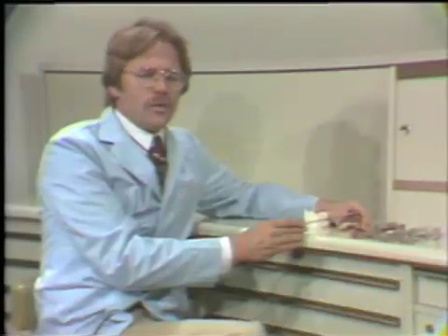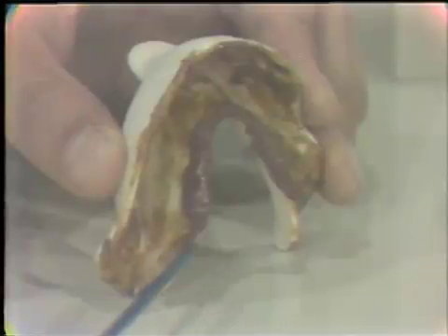On some patients, there may be a need to make a custom tray for the diagnostic cast. We would utilize an acrylic custom tray — specifically for patients where the attachments of the floor of the mouth are very high, and the lingual bar area and soft tissue attachment is going to be very critical in the design of the appliance. We would first make a routine impression in the metal tray, then from that make an acrylic tray, and modify the lingual area of that tray with compound, as shown here.